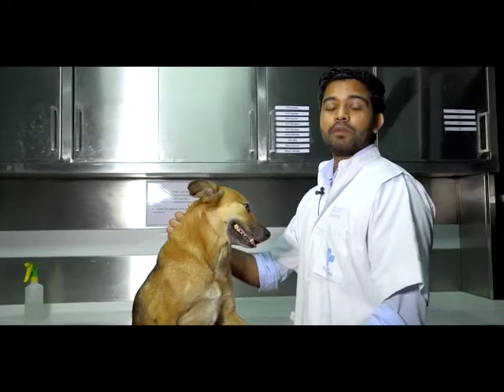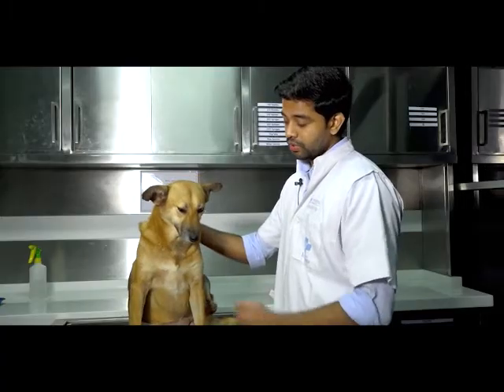Hello everyone and welcome to the demonstration on routes of drug administration in dogs. So here we have Hamina with us to show you the routes of drug administration in dogs, and we are planning to discuss four main routes of drug administration in dogs, namely the subcutaneous route, the intramuscular route, the per oral or where you would administer drugs orally to dogs, and finally the intravenous drug administration and catheter placement.